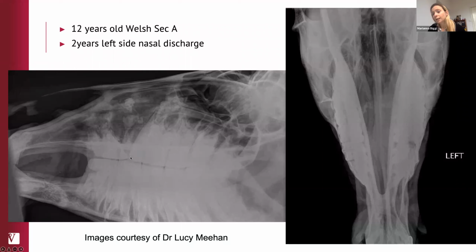I can't quite see a diastema in these radiographs, but I suppose there is, and that's because of the change that I can see dorsal to this within the nasal cavity. There is increased opacity, but that is not quite fluid opacity, in the sense that to me this has a sort of striated pattern. In addition to that, there are mineral opacities within these nasal cavities, and also more caudally, dorsal to the root of the 07.